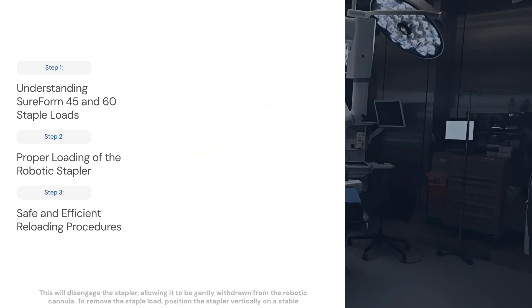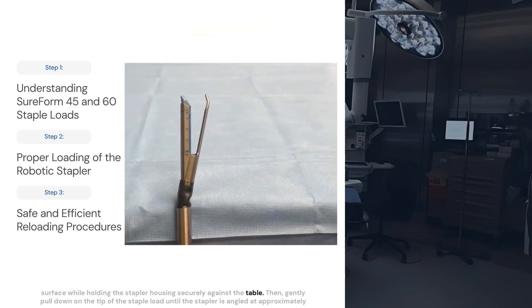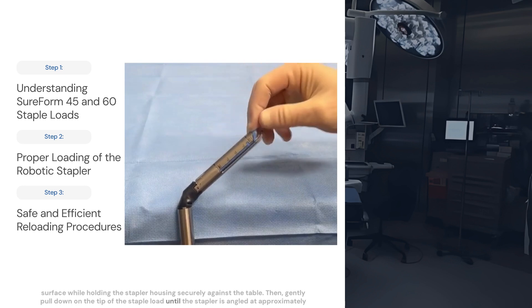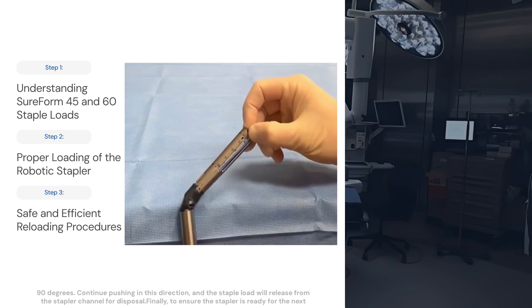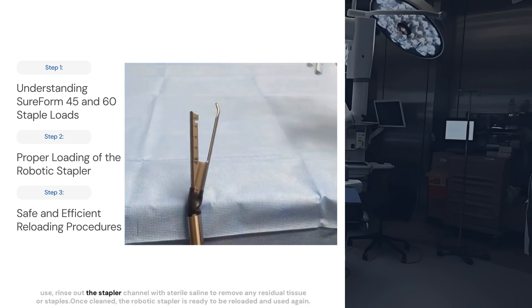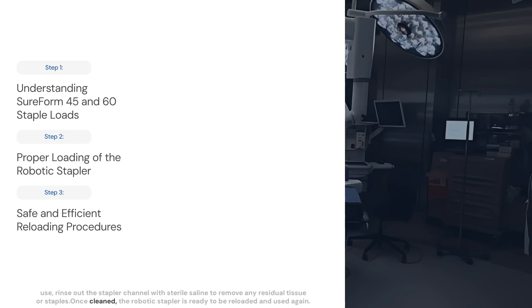To remove the staple load, position the stapler vertically on a stable surface while holding the stapler housing securely against the table. Then gently pull down on the tip of the staple load until the stapler is angled at approximately 90 degrees. Continue pushing in this direction and the staple load will release from the stapler channel for disposal. Finally, to ensure the stapler is ready for the next use, rinse out the stapler channel with sterile saline to remove any residual tissue or staples. Once cleaned, the robotic stapler is ready to be reloaded and used again.